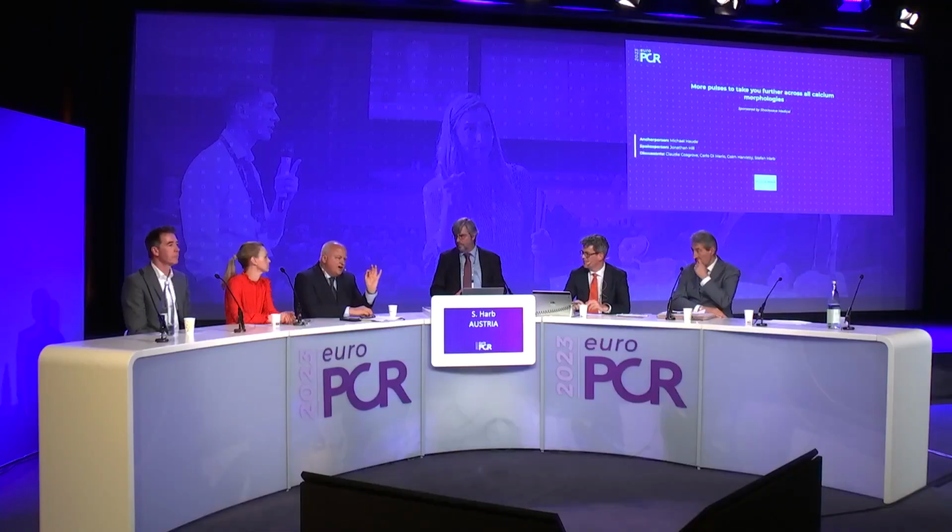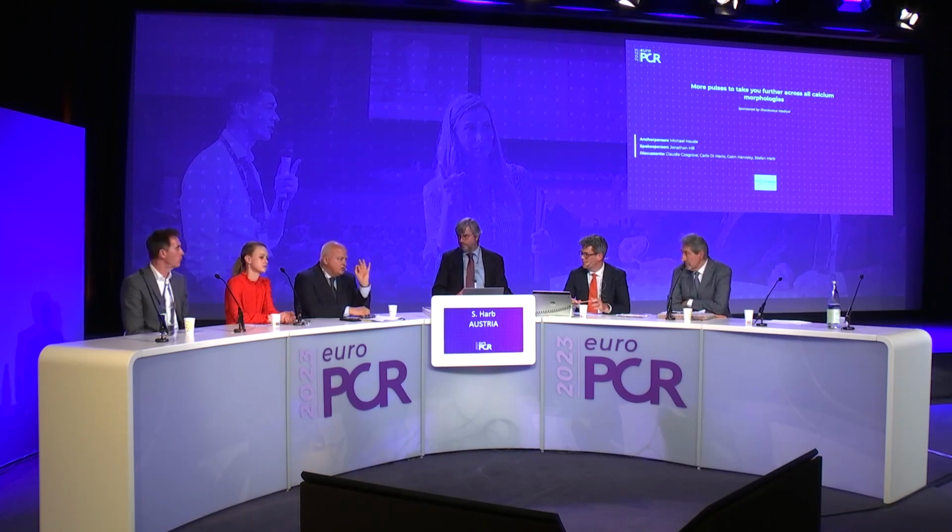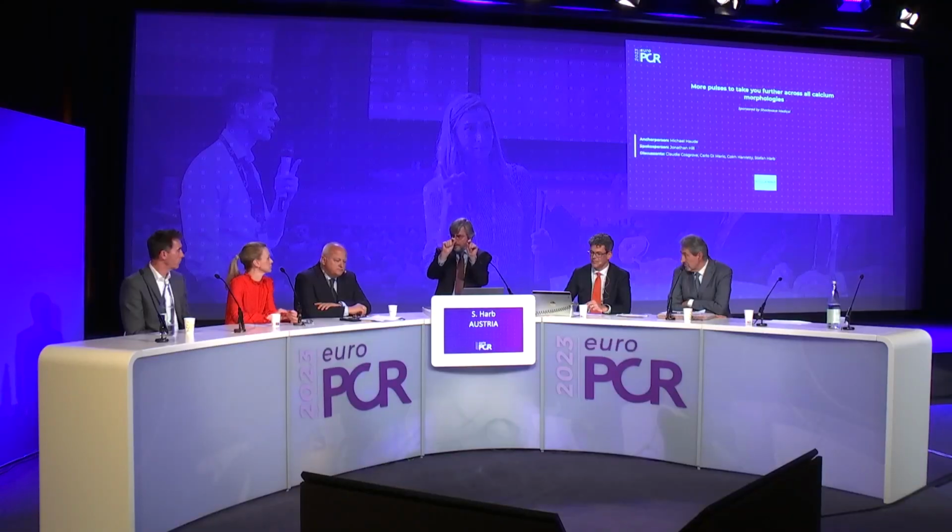Stefan, thank you. Thank you very much. One thing I would like to know from you: when you address a calcified nodule by IVL, how exactly do you position the emitters of the IVL catheter according to the nodule? If, like in this case, I know exactly where it is, I can see it on angio, I can see it on IVUS. I know that, as Claudia has told us, we have the most effect in between the emitters. So I make sure that in between the emitters, I use the emitter distal and proximally. And what I did in this case, I moved a little bit distal, a little bit proximal, just a few millimeters. So I also used the full radial force coming from the emitters.